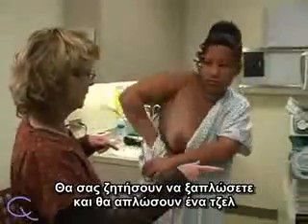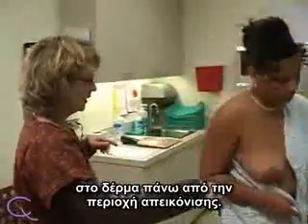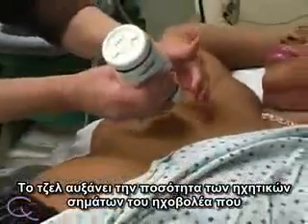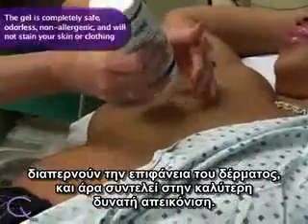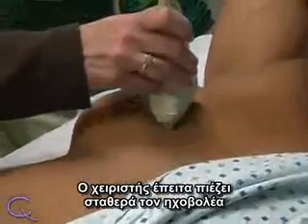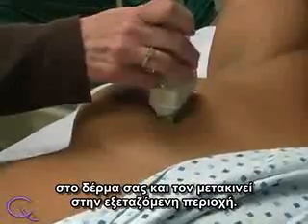You will then be asked to lie down on the exam table, and a gel will be applied to the skin above the area to be imaged. The gel increases the amount of signal from the transducer that penetrates the surface of the skin, thereby producing the best possible image. The technologist will then press the transducer firmly against your skin and move it over the area of interest.